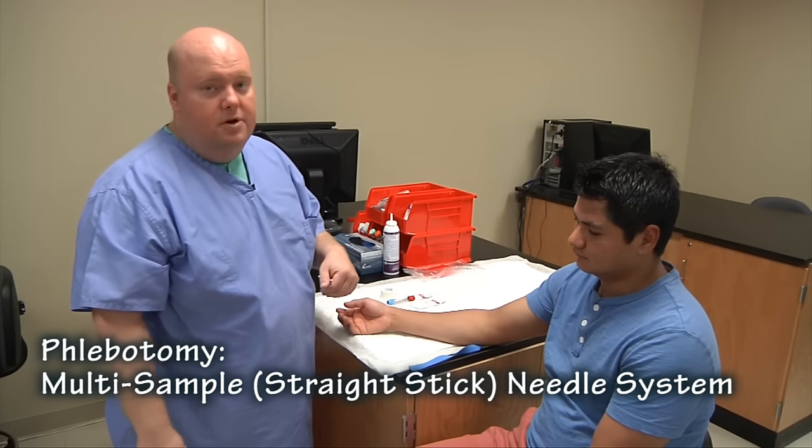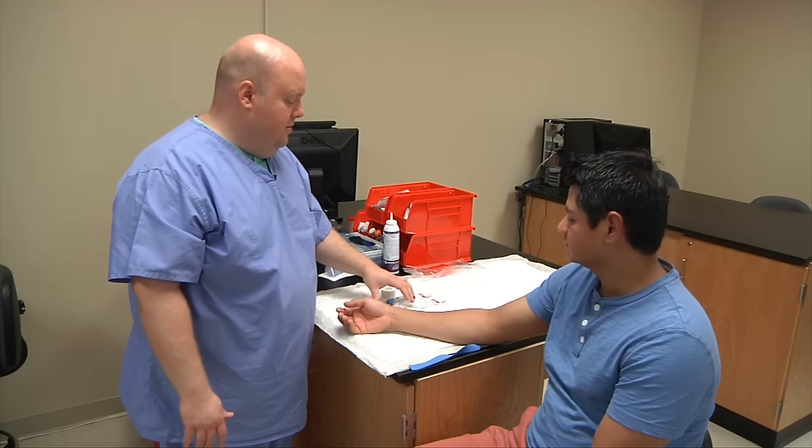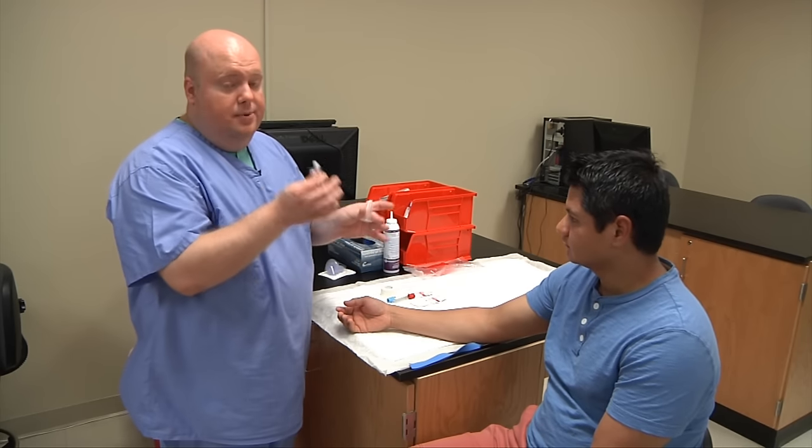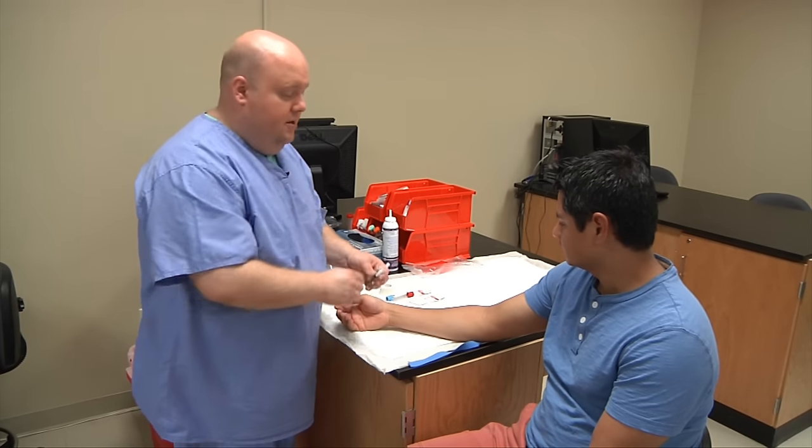Today we're going to perform a venipuncture on our patient. We're going to use the straight draw method with just a regular multi-sample needle. It will be accessed in the antecubital fossa of the patient's body.